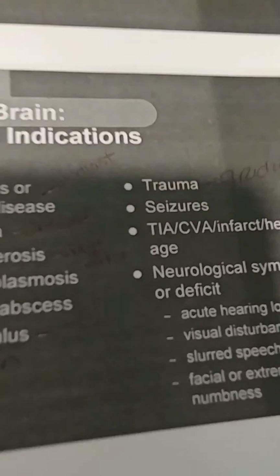Okay? TIA, CVA, infarct. What are we running? Those are stroke. Right. So what are we doing? Diffusion. That should be routine, but it didn't used to be. We used to only run them on CVA patients, but when they got perfected down to less than a minute, it's stupid not to do it on every patient. Does a 16-year-old that's in there for headaches really need it? No. But it's less than a minute long.